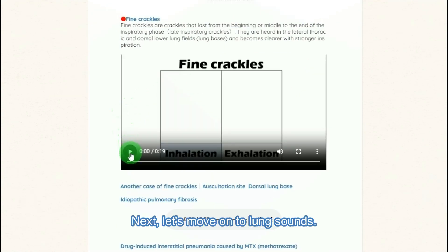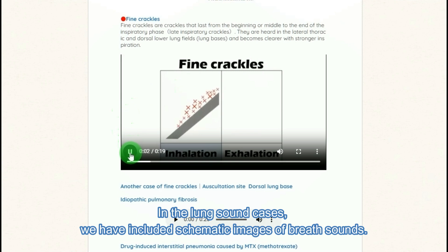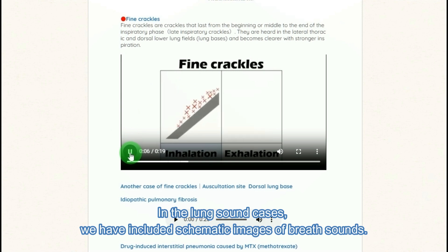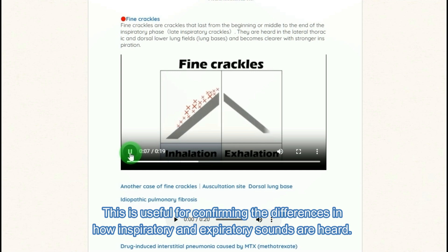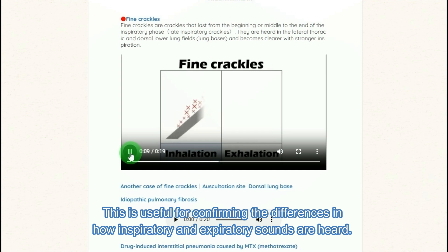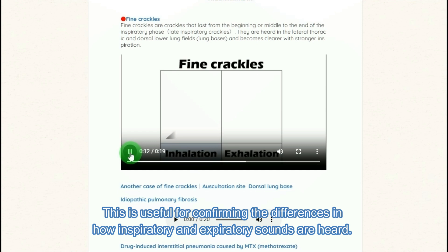Next, let's move on to lung sounds. In the lung sound cases, we have included schematic images of breath sounds. This is useful for confirming the differences in how inspiratory and expiratory sounds are heard.